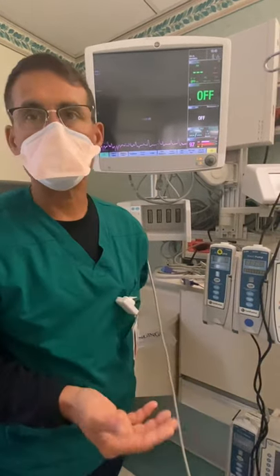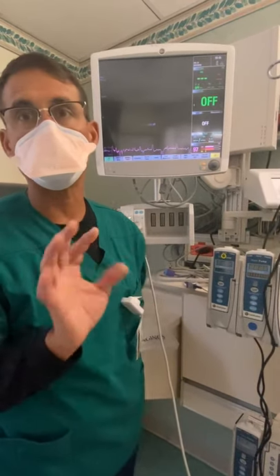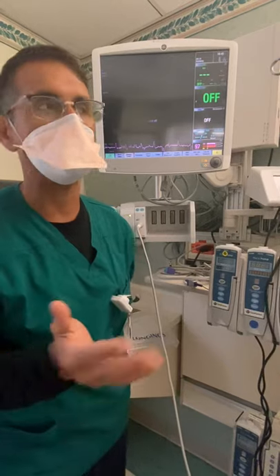Let's say that you don't have a BIS monitor and you still have to titrate on your patient, because we have 10 of these, but we've had more than 10 people in paralytics.